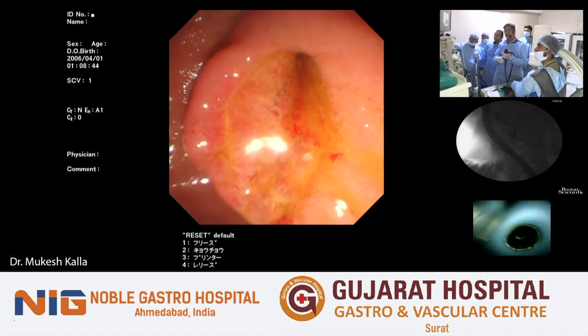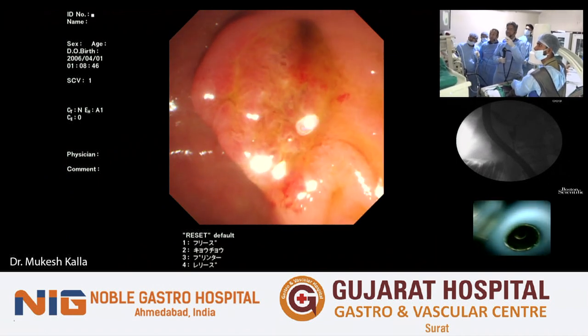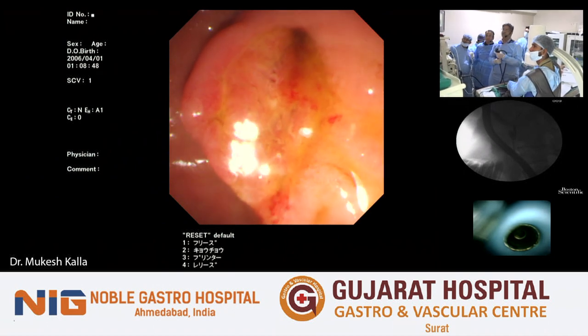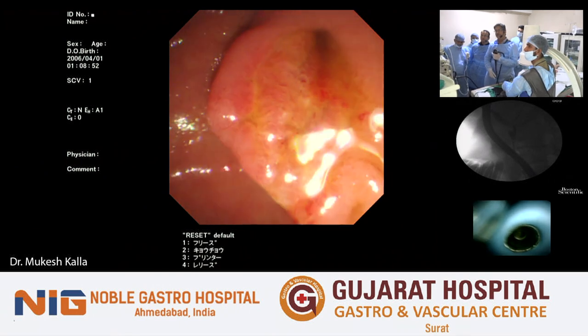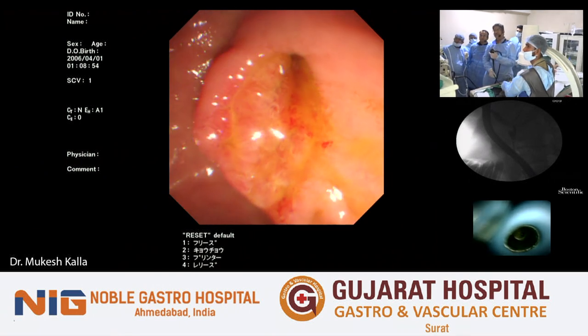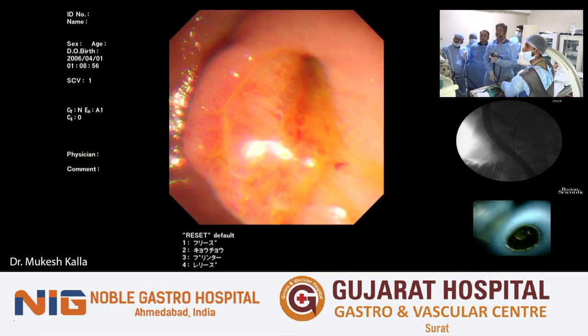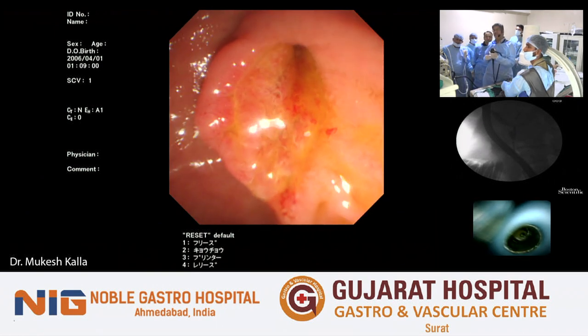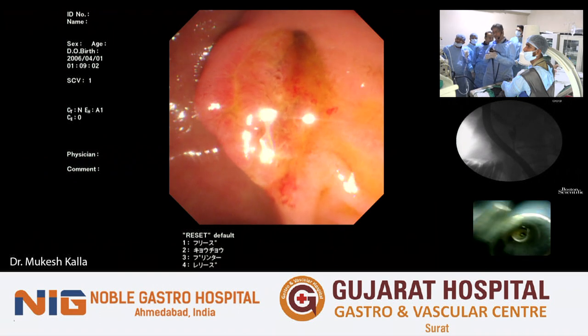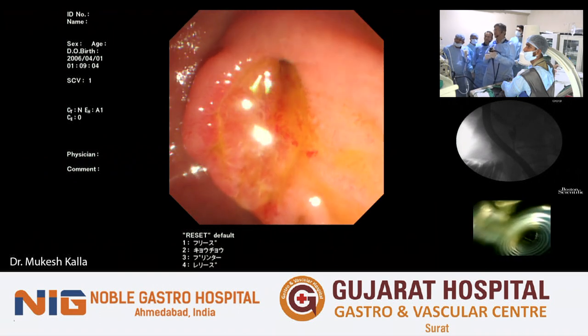So the sphincterotomy is adequate, but if we were dealing with a stone which was like 2 centimeters or 2.5 centimeters or a larger stone, I would probably prefer doing a sphincteroplasty here. The intention of doing a sphincteroplasty is to ease the taking out of the fragmented stones, one, and to protect the bending section of our scope as well.